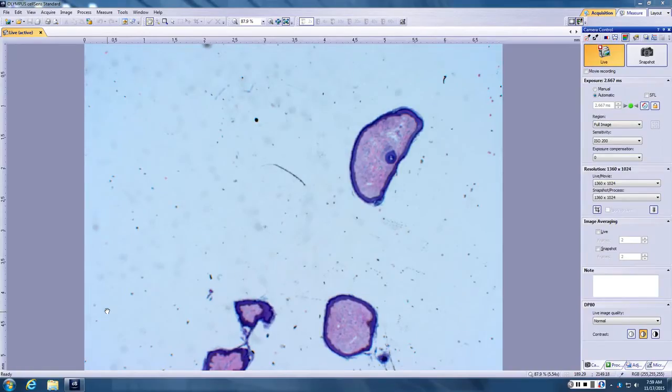You can see it in Birt-Hogg-Dubé, along with the fibrofolliculomas, and you can see it in MEN1. That's the other big one. And this patient was worked up and turned out to have MEN1. Right, I was forgetting about that one. So, just remember, any solitary tumor is likely to be sporadic.